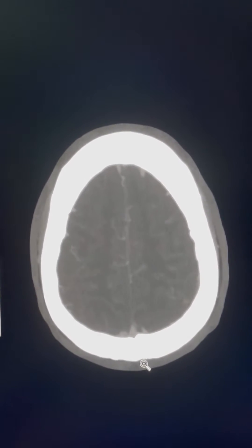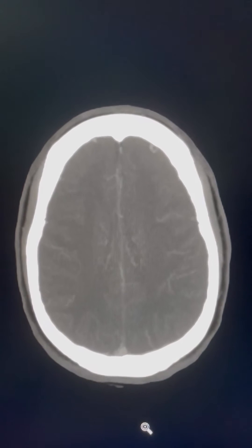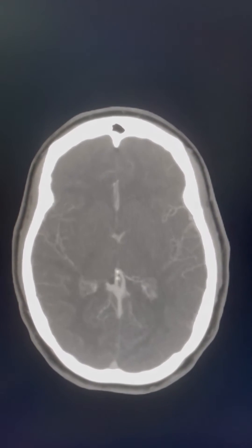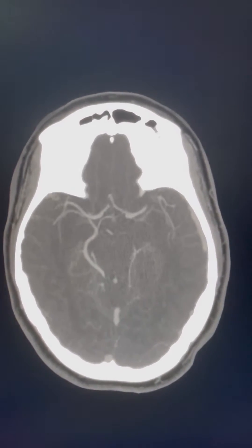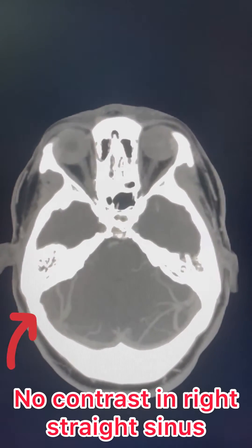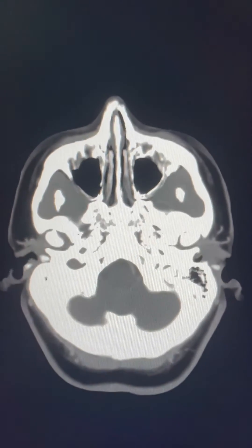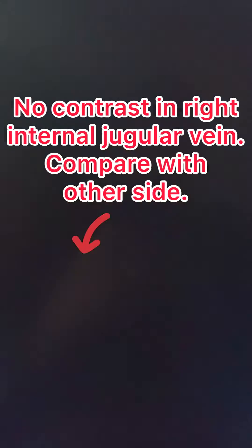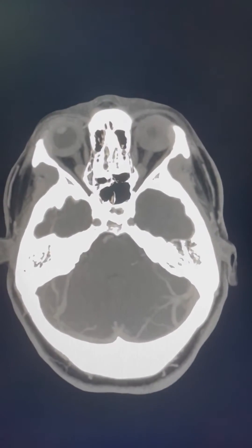Now looking at the CT venogram, we can see normal filling of the venous system. As we go down, we will see a filling defect in the right transverse sinus. Here you can see the filling defect in the right transverse sinus, and as we move further down you will see a filling defect in the right internal jugular vein.